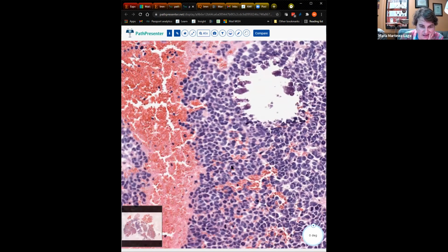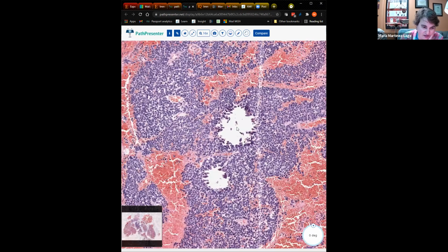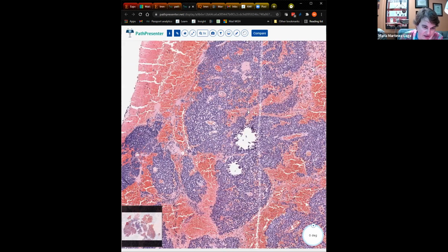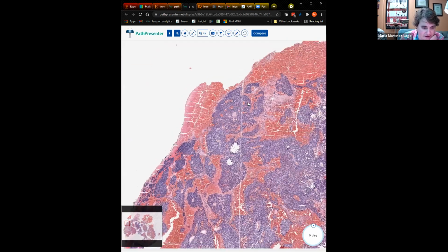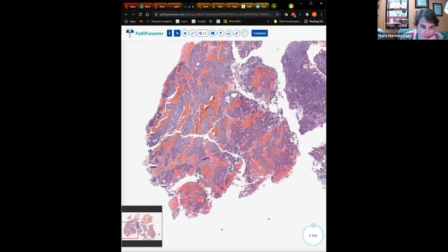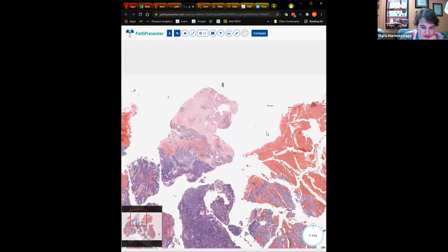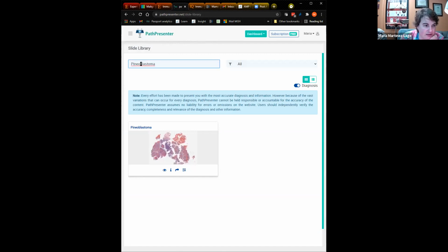Okay, so here's an area of calcification. That's something that you will expect to see in the normal pineal gland, so that might be a clue that that's where we are. The pineal calcifies with age, but it starts relatively early. But again, there's really not a lot of good normal background pineal here to use. So I think that's the only one there was.